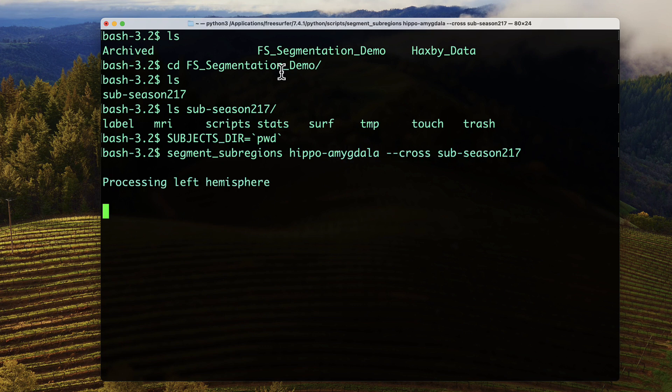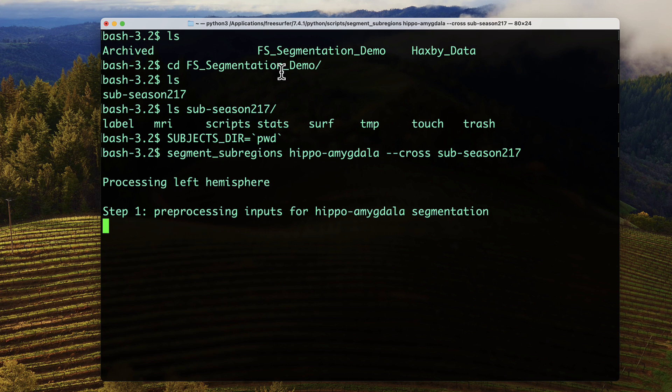On my machine, this takes about seven minutes to generate different levels of granularity for the segmentations for both the right and left hemispheres.